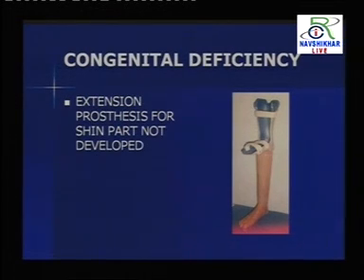Straight away in this, the shin is not there. Only the foot is there. The upper portion is not there, at the hip portion. See, the foot is at the knee level, below the other leg hanging at knee level, and that's why we have to elongate it to the lower level. Means we have to provide a shin block instead of providing a hip and thigh portion actually.